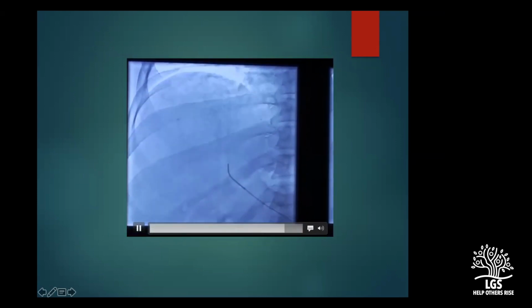And once we identify the tumor, this is when I actually decide whether to go for a conventional TACE or a DEB-TACE at this point as well. Sometimes you don't see a very clear arterial blush. If you don't see a very clear arterial blush, we should not be doing DEB-TACE. DEB-TACE is drug-eluting beads.